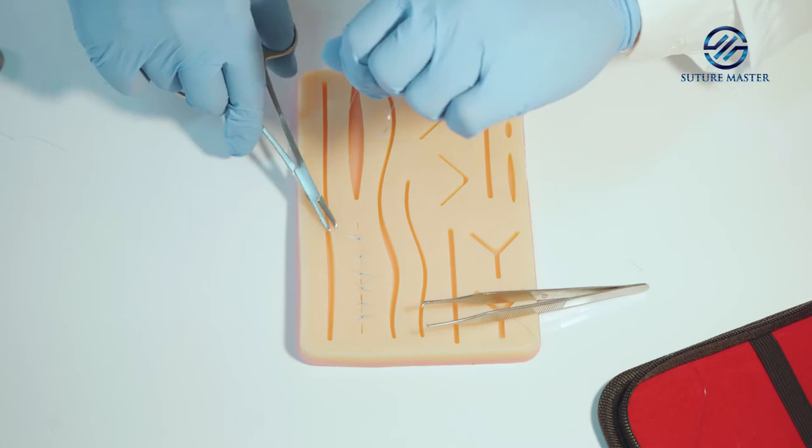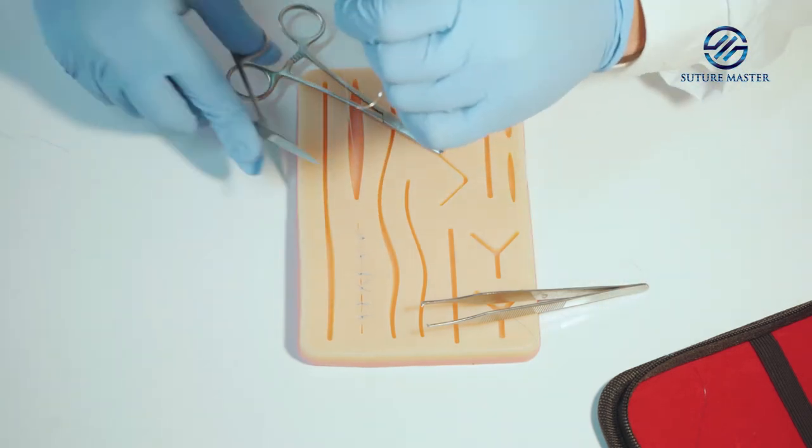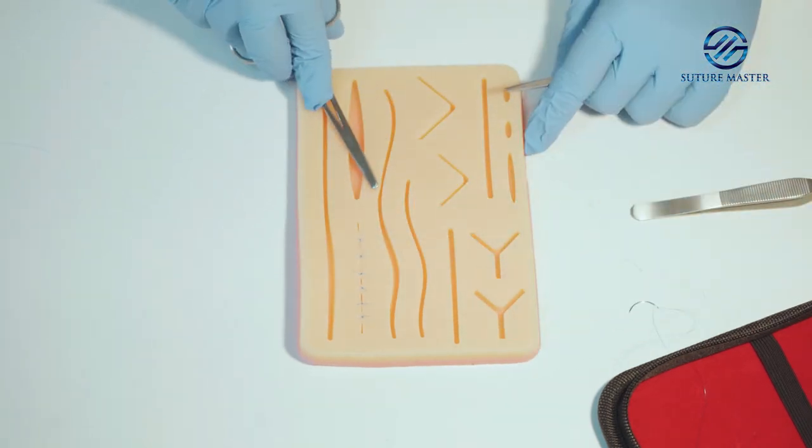Once the knot is tied, use the needle holder to pull the knot to one side so it's not overlying the wound.